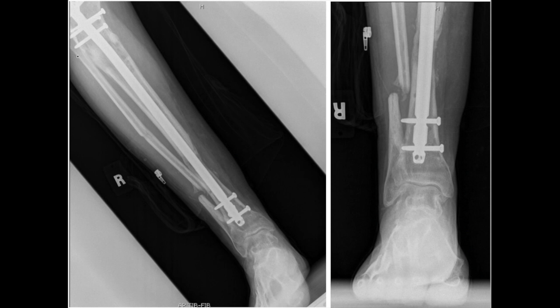He exhibited decreased sensation over the anterolateral proximal tibia; however, distal sensation was intact and he demonstrated 4 out of 5 strength of the anterior compartment muscles. Radiographic imaging revealed signs of bone graft consolidation and healing in the lateral and anterior tibial cortices.